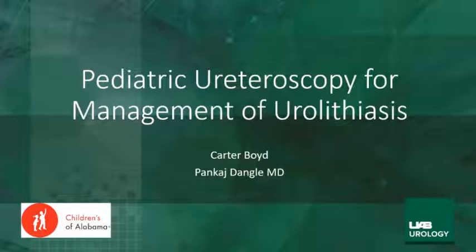If there are signs of persistent pain, vomiting, or urinary tract infection, and based on the size and location of the stone, some of these patients may need interval ureteral stent placement. After a preoperative evaluation, obtaining a negative urine culture, and waiting 2 to 4 weeks for passive ureteral dilation after ureteral stenting, the patient is subjected to ureteroscopy in dorsal lithotomy position.